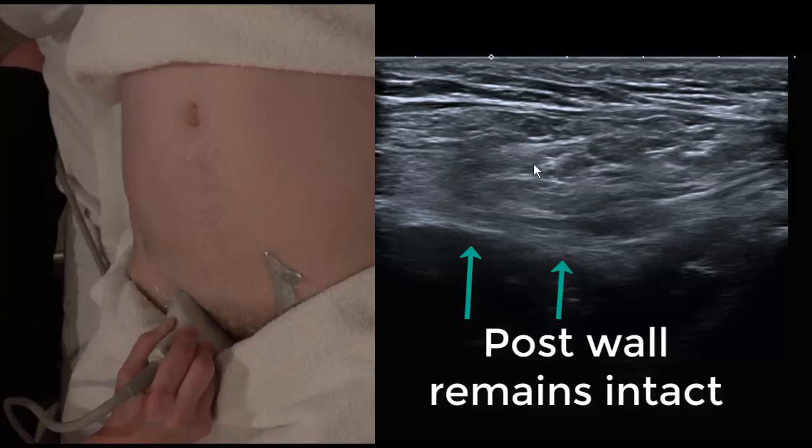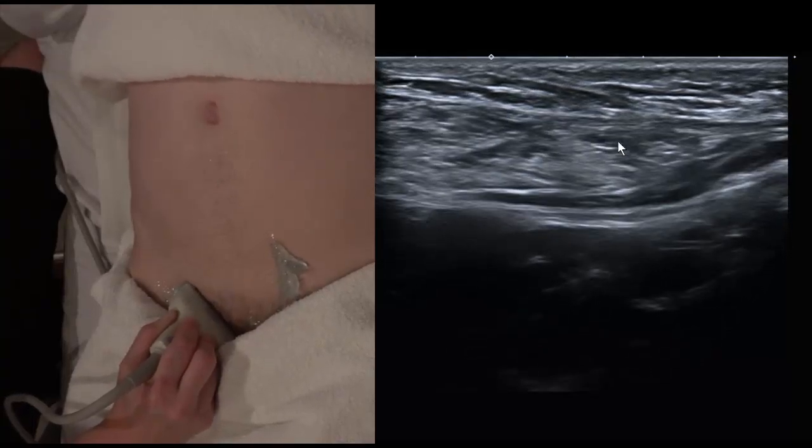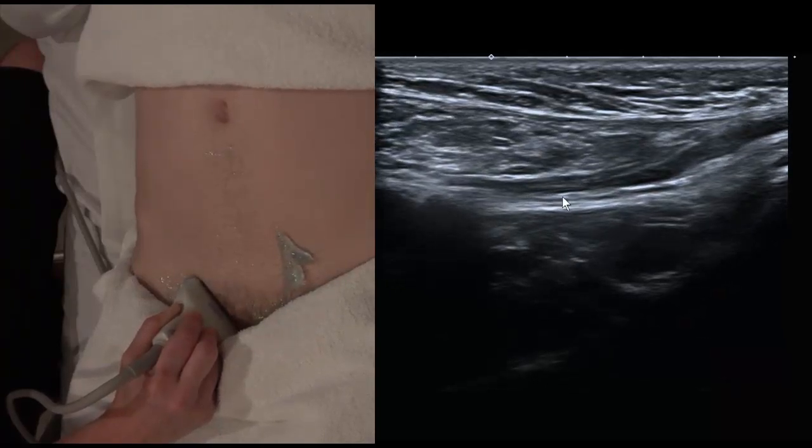We can see the little indirect hernia sliding left to right across the screen, whereas direct hernias tend to bust up towards the transducer vertically — a bit like an atomic bomb.